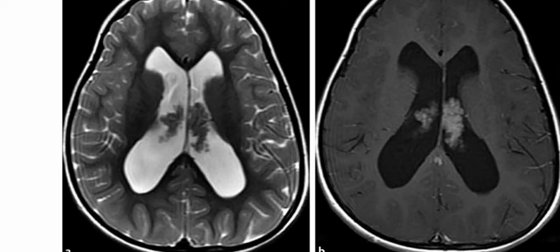On the axial post-contrast sequence, we can see that there is avid symmetric enlargement and enhancement of the choroid plexus without a focal mass. And both the lateral and third ventricles are enlarged on the coronal image. This is the coronal sequence post contrast, and it shows that there is enlargement of both the lateral and third ventricles.